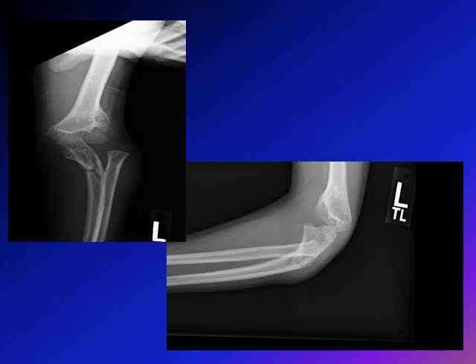This is another case of Monteggia fracture dislocation so you can gain more experience in detecting it on x-ray. You can see here an obvious fracture of the proximal part of the ulna, both on the AP and lateral views. However, if you look closely at the radius and draw a line, it is not close to the capitellum and is not bisecting the capitellar head. This is also another case of Monteggia fracture dislocation.